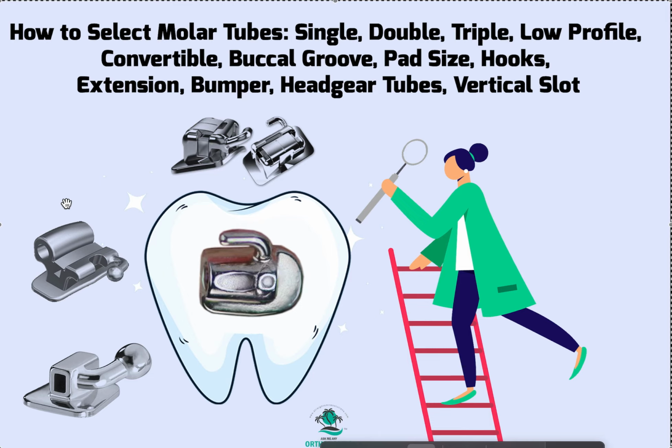So again, recap. Do 022, Roth or MBT, single molar tubes, low profile. That's all you need to know. Oh, and of course, hooks. Most importantly, you must have a hook. These all have hooks. Absolutely have a hook, because odds are you're going to need to put power chain on, and it's really hard to tie a Kobe to a molar bracket. Sometimes the hooks break off, and that's kind of a hassle when they do. Or they can get all gunked up with calculus.